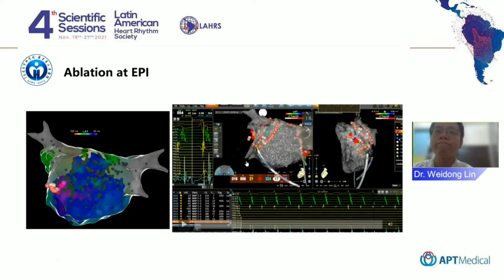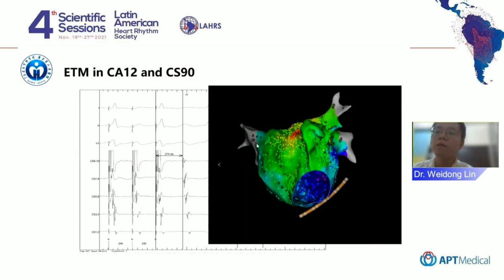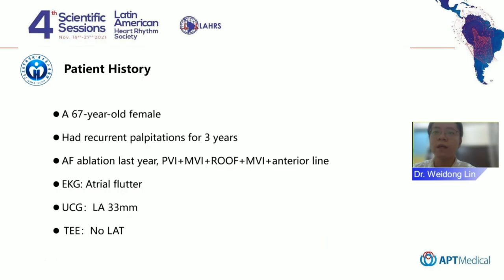So it is a very interesting phenomenon that this kind of tachycardia, we can see there is a focal pattern of activation, but we can break it here during the catheter ablation and then terminate the atrial tachycardia. So what is the definite mechanism?